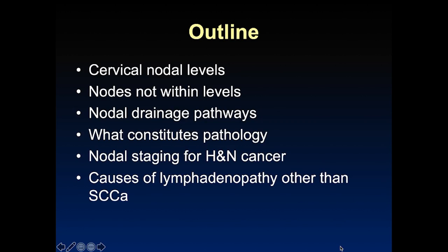So we're going to start by defining the cervical nodal levels in order to help facilitate your communication with your referrers, including your ENT surgeons. We're going to discuss some special nodes that are not really located within levels, but are important nonetheless to be able to identify so that you can see them when there's pathology in those areas.